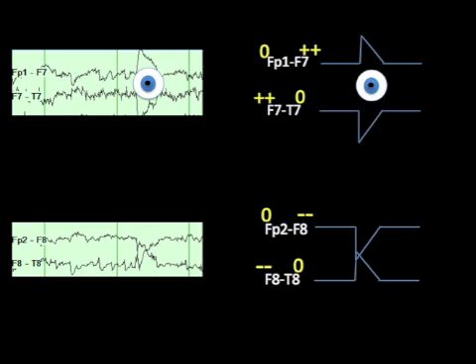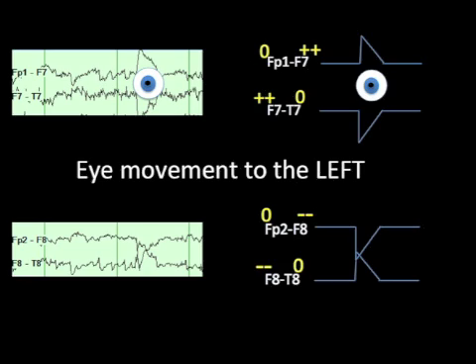If we look down at the first two channels in the right temporal chain, we see that the tracings are moving toward each other, eliminating space so that we could not put an eyeball in this space. This further confirms that this is an eye movement to the left.